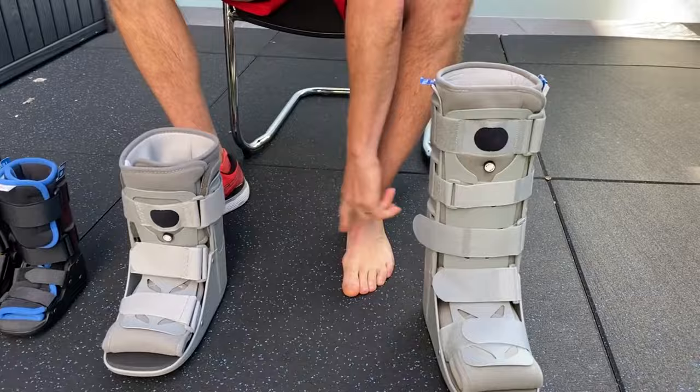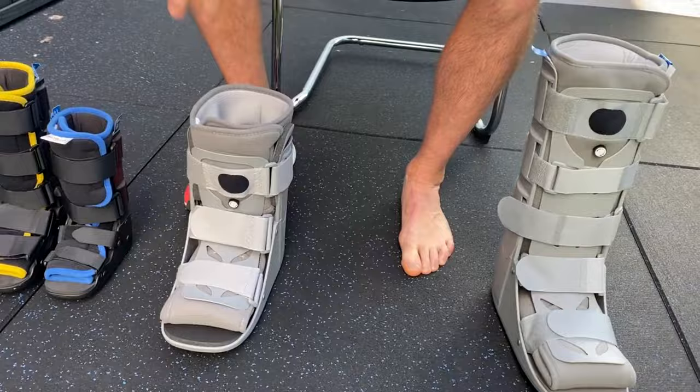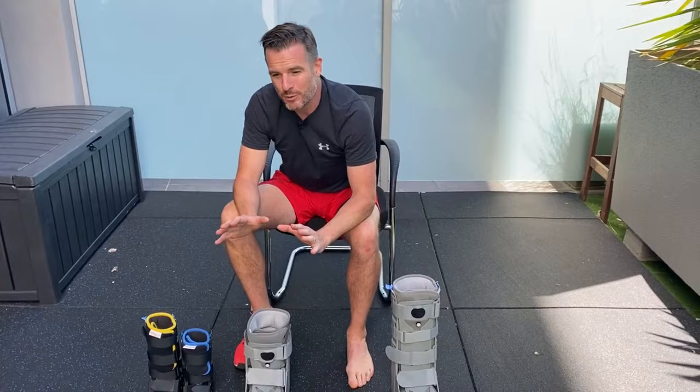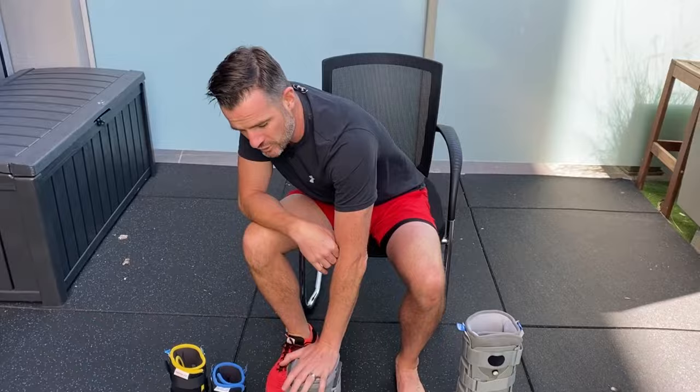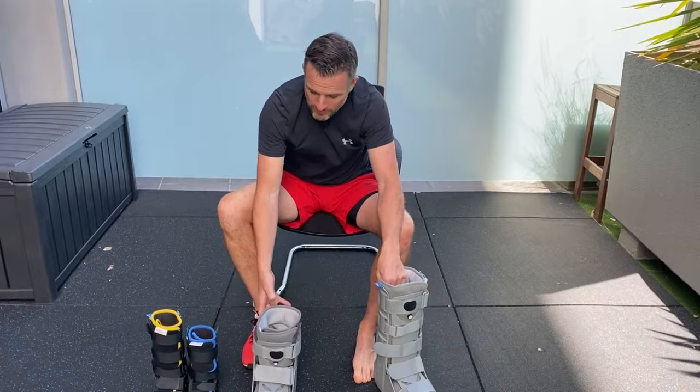If you've got a foot problem — foot surgery, a midfoot sprain, toe surgery, a toe fracture, or a stress fracture from heavy running or dancing — then a short walker boot is for you. You don't need the tall one because ankle movement is okay; you're just limiting what's happening in the foot.